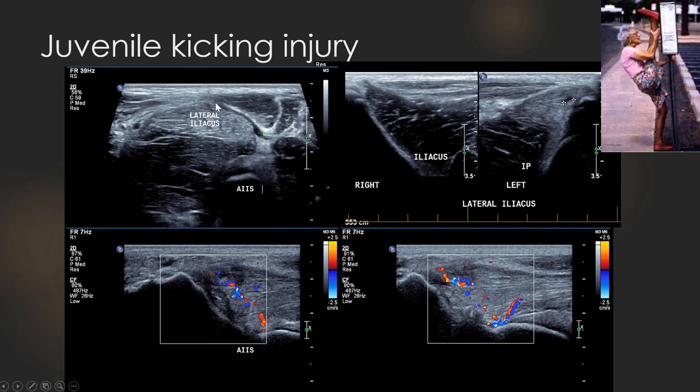Okay, just a couple more cases to finish. When we're doing examinations of the anterior and lateral hip, if someone just had a pop sensation and pain, it might not necessarily be that the pop is repetitive. The click might have just been a once-off.